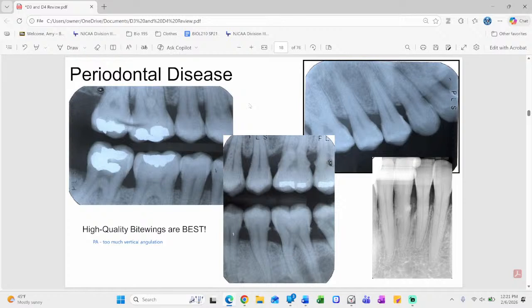It is a tool to be used, perhaps a patient education tool also to show, but I've had images where huge caries and it didn't pick it up. It didn't see it. So, shaker of salt. You've heard that old expression, it's a shaker of salt. It's a tool in the tool belt, but you can now use it back in radiology.